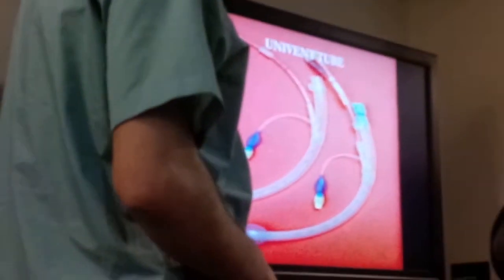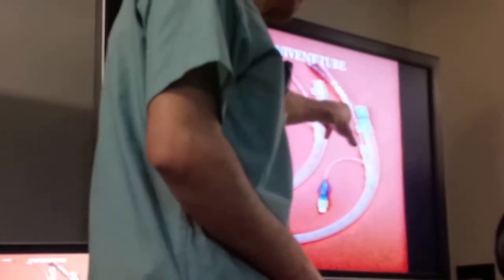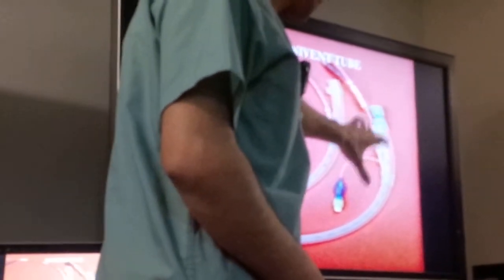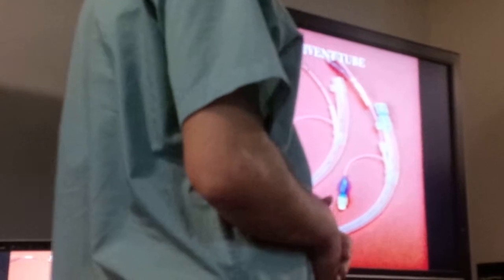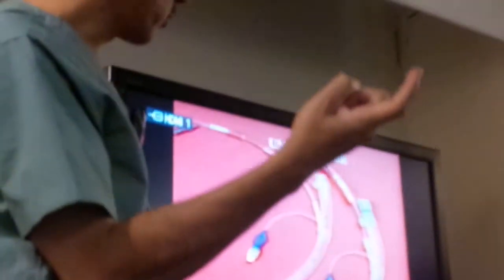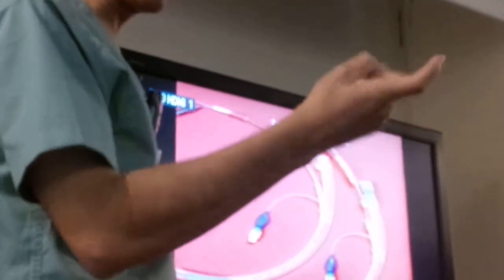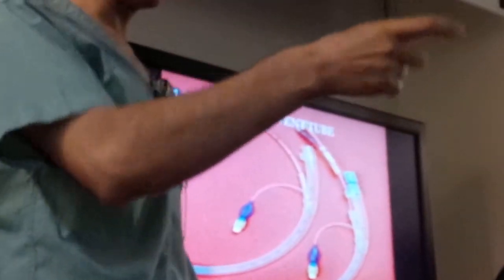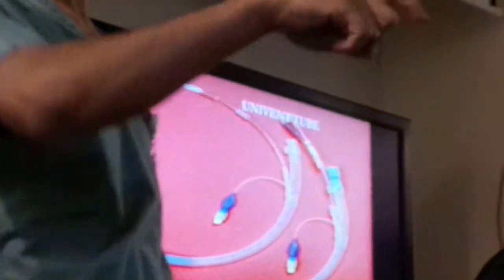The Univent has an anterior slot for the bronchial blocker, with the reading for the height of the mark of the bronchial blocker. It's anterior, and if you look, the tip is not straight; it's flexed. So to isolate both, how to manipulate? You can just rotate it from up, so the tip will go to the right side, or left side.